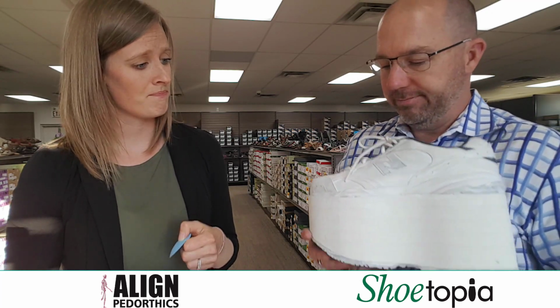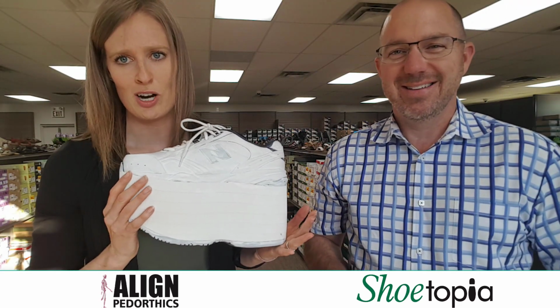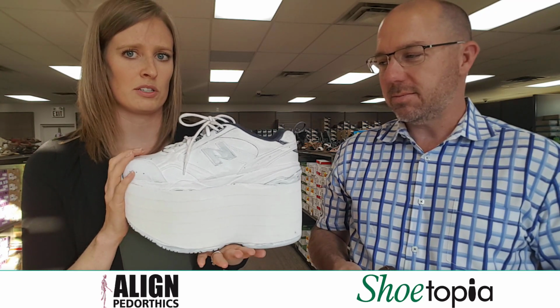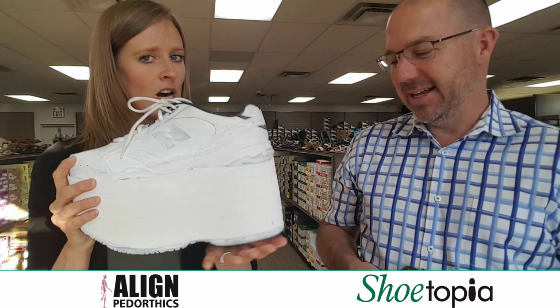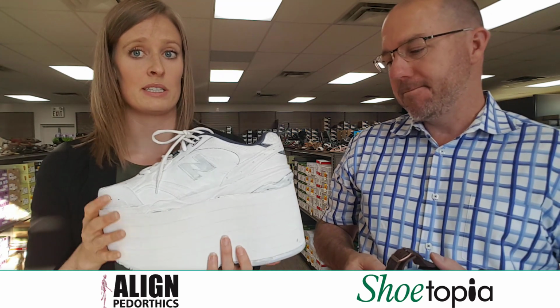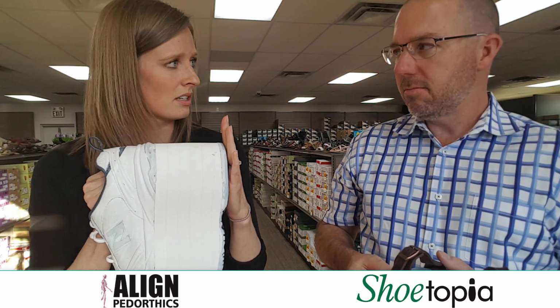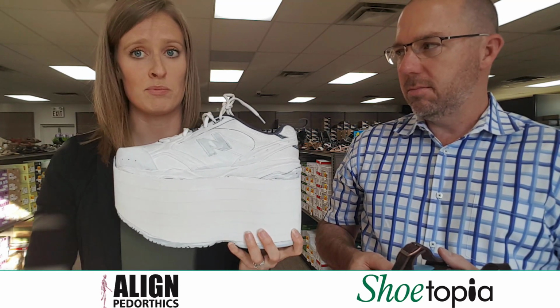Yeah, that's cool. So this is one of those things that's obviously not very common that we would do, but this is a shoe lift. We can do lifts inside the shoe to a certain extent, and then at a certain point you have to go outside the shoe. This one you can't do inside the shoe. You definitely can't. This is for a gentleman that was in a car accident. His one leg is a lot longer than the other, about 12 centimeters, and we have to build up that difference somehow. So this sole has been cut open, the lift added in, and then sandwiched with the existing sole back onto it, and that way he can walk more evenly, and his hips and pelvis can stay even.